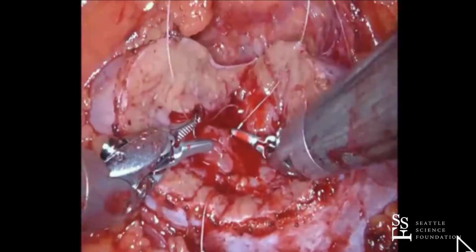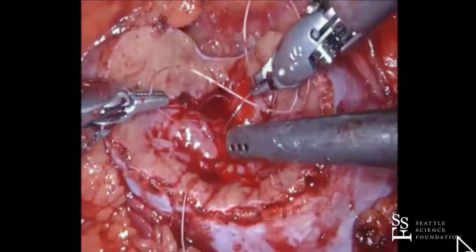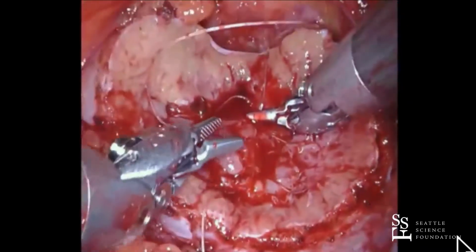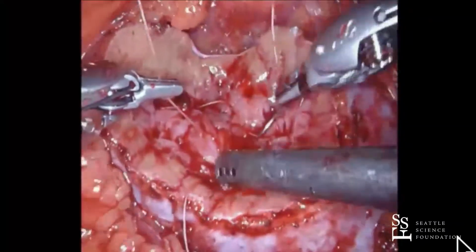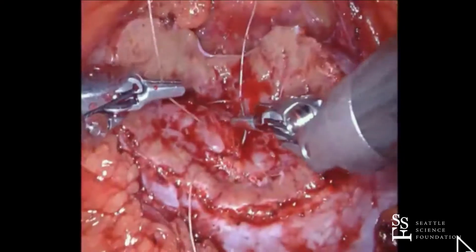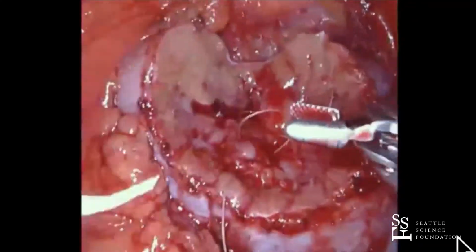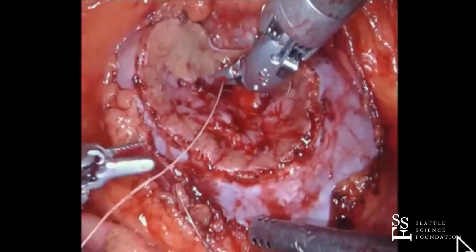Well, Jim, I'll agree with you that if you're individually suturing vessels and you're tying down knots, the barb sutures are really not very good because the knots are thick and it's definitely not a feel for that. If you're running from outside parenchyma through the inside back to the outside, as I do, and it looks like Ronnie does, then it becomes less of an issue. So if I was doing what you're doing, I wouldn't use the V-lock either.